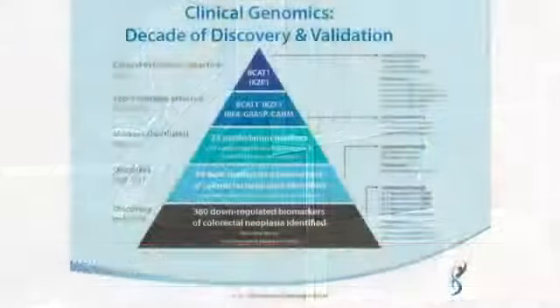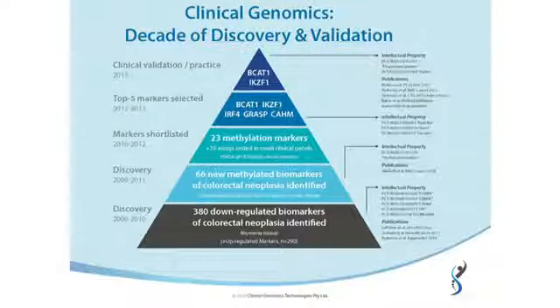So at Clinical Genomics, we've spent about 10 years looking at circulating tumor DNA, or in fact, probably a better way to put this, 10 years looking at biomarkers for colon cancer that we think have application in blood. And along the way, we've looked at lots of different things. We've explored CTCs. Our base technology was on messenger RNA, gene expression changes up and down. We've explored exosomes, microRNA, CTCs more recently. But where our research led us, in particular, was to focus on epigenetically silenced gene targets.